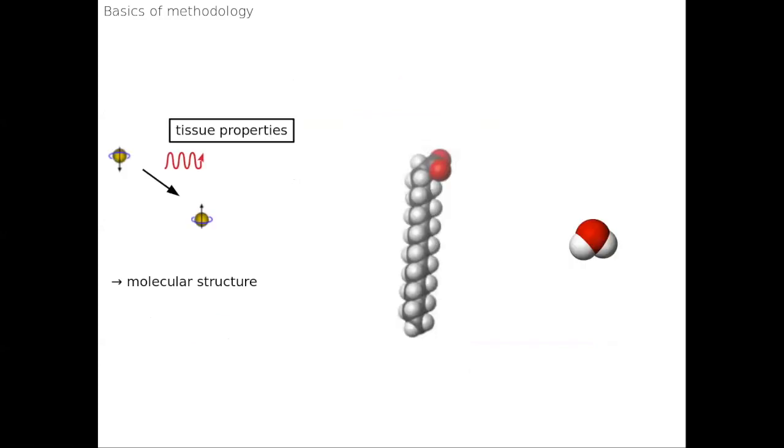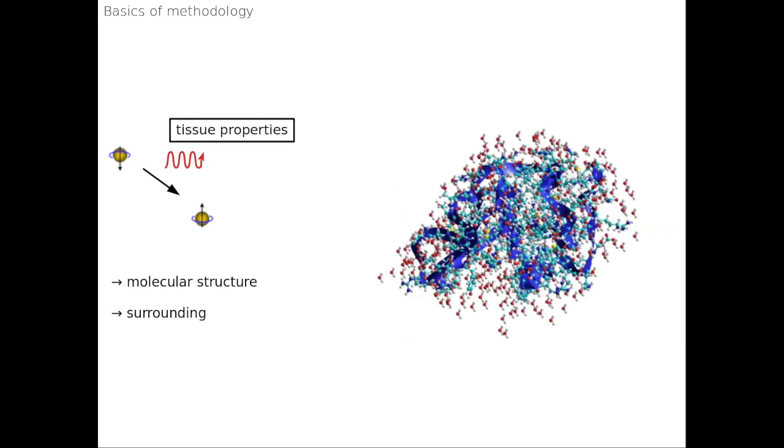And so the different tissue properties that we look at is, of course, the molecular structure. And here, as we use proton imaging, we will look at mainly water and also the protons in fat. We have also the water molecules that surround proteins and different structures in the peripheral nerves that will also interact with the water protons and change the signal behavior.